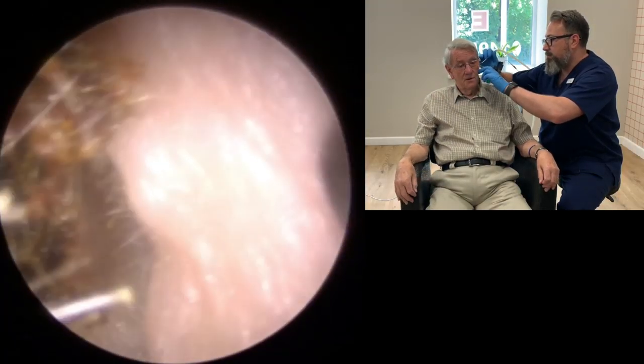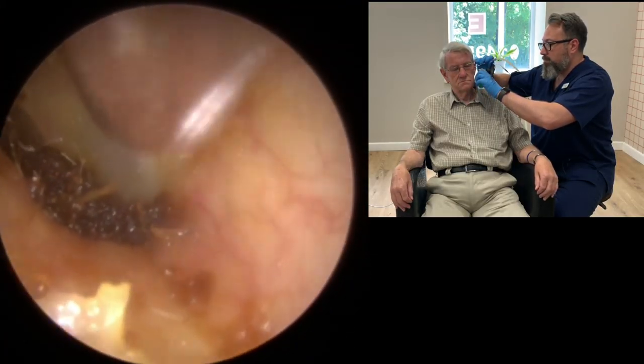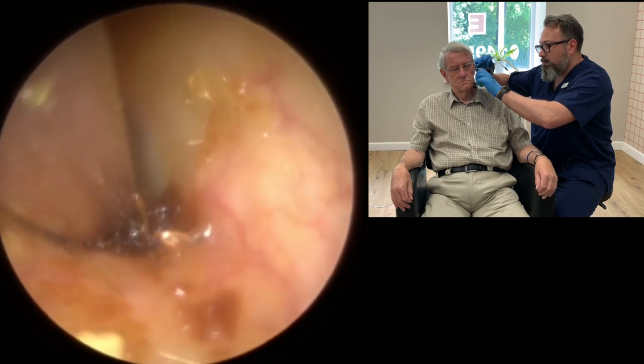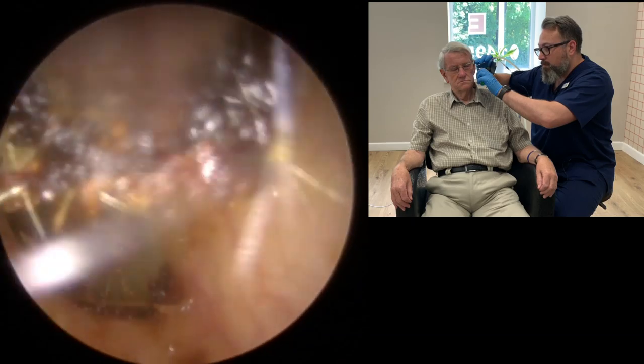Back in now, just get rid of that little chunk on the outer part of the ear canal. So what we've got now is some very soft wax sitting really close to the eardrum. So we're just going to clear as much of this away. There we go. We've taken that off the drum now. That's the section that was just blocking against the eardrum.